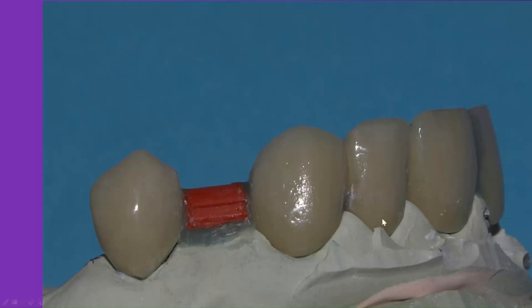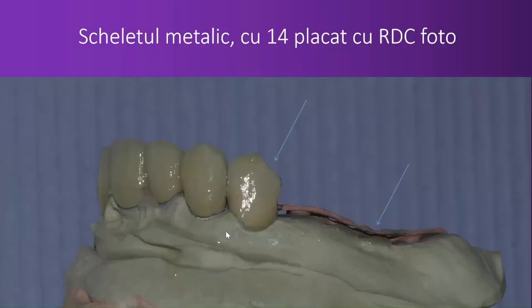It's just to imagine that at the end, when I cast the metal part, this shape will remain inside of the metal, right? And in that, I will place the rider that will do the click, okay? Now, you see the metal framework already cast. It is at a distance, obviously. Here is the bar inside this tooth. You don't see it because it's inside of this first removable tooth, okay? It's plated with composite resin.